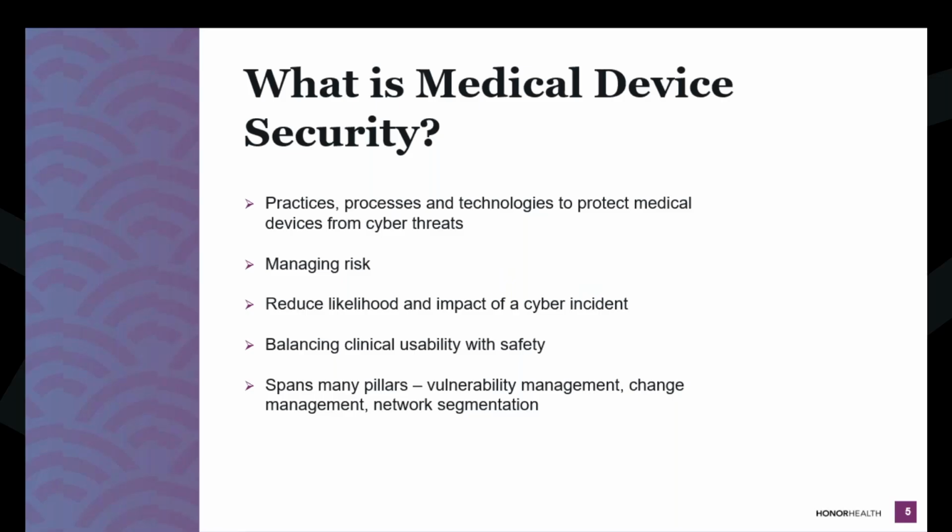While we're trying to rein it in, limit that connectivity to other systems and to users, and manage that access, we also need to look at usability of the device. If we're applying all the controls we can to make this equipment secure, is it still usable for the clinician? Can they still do what they need to do with this piece of equipment? We can walk away at the end of the day and say it's secure, we're good, but the clinician can't use the equipment. So there's a fine balance of safety and usability.